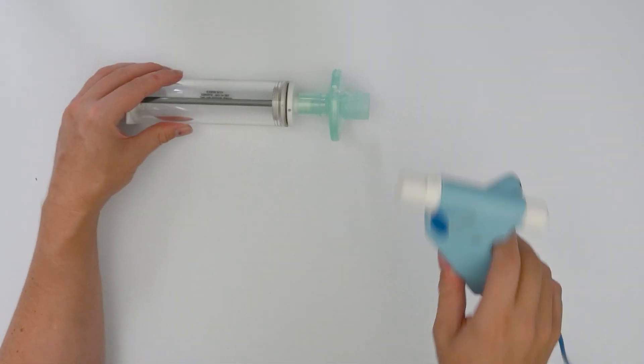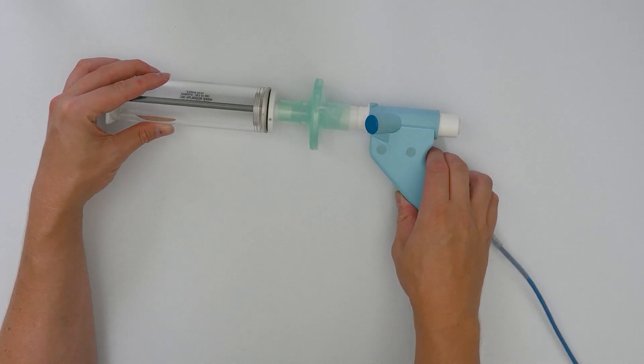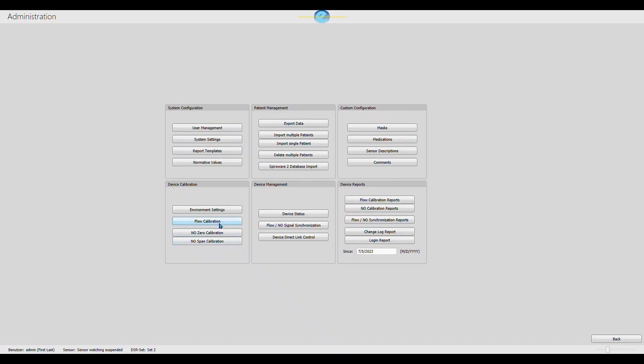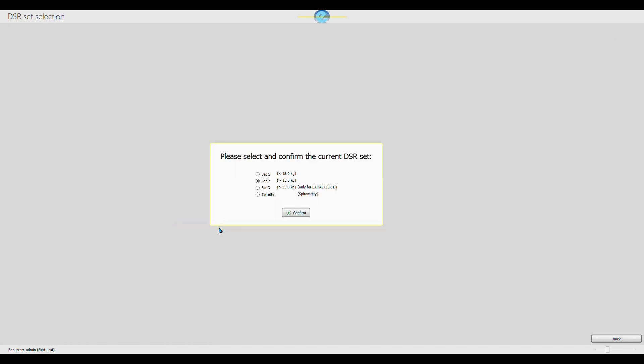Attach the dead space reducer with a bacteria filter to the calibration syringe. Start the flow calibration procedure in SpiroWare software. This can be done by going to Administration and selecting Flow Calibration. Confirm the selection of the appropriate DSR set.